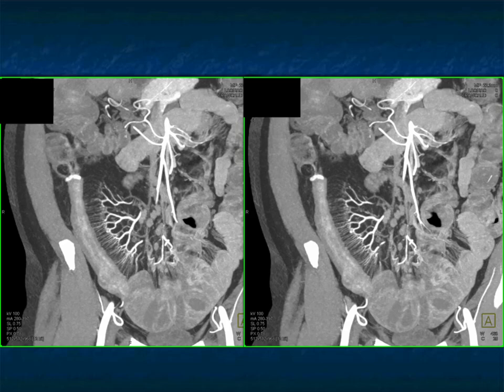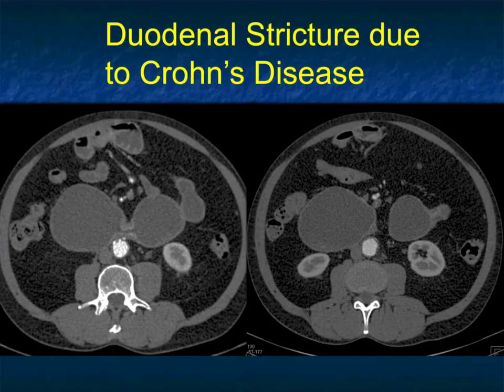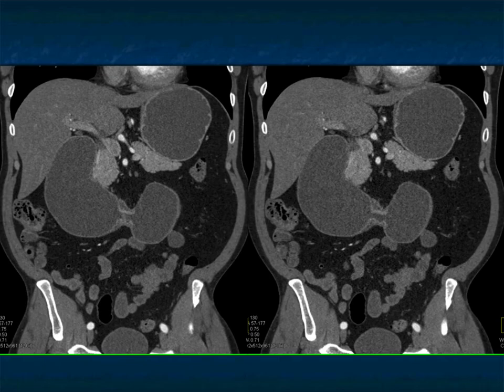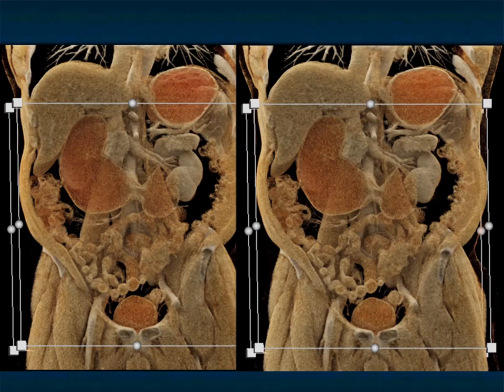One comment: with Crohn's disease, thickening is usually symmetric. The question always is could this be a neoplasm? Crohn's patients have an increased incidence of carcinoma and even lymphoma. The cases I've just shown have all been terminal ileum — but look at this case: dilated bowel, a stricture here and another stricture there, all in the duodenum. This is Crohn's disease. We like to think about Crohn's as involving the distal ileum near the ileocecal valve, but it can be proximal — it can even be in the stomach. You considered malignancy, you considered a stricture, but there's no real soft tissue mass, just a really impressive example of Crohn's disease.